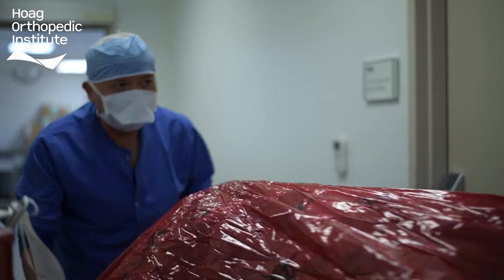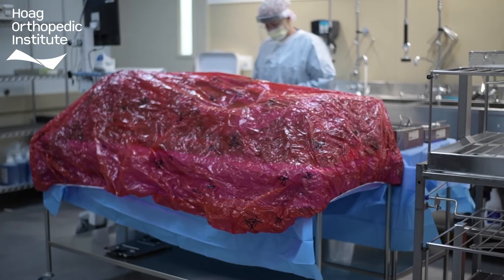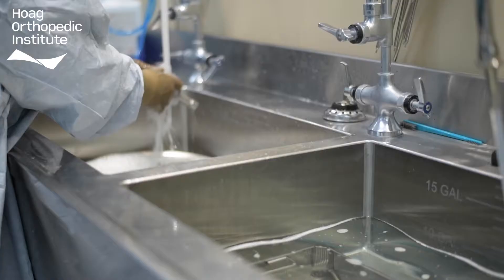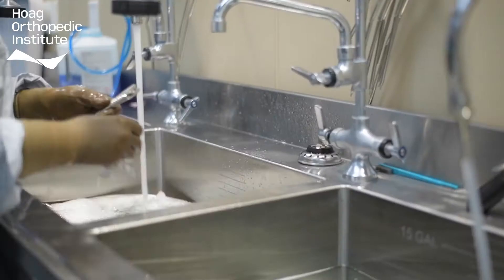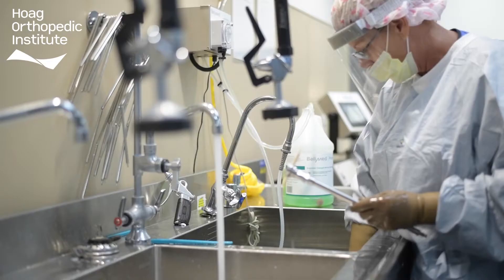At HOI, instruments are returned to the decontamination room after surgery and the instrumentation reprocessing begins. This process starts by soaking and manually cleaning each instrument in a water and detergent mixture. This helps to break down the blood and material left on the instruments post-surgery, also known as bio-burden. A variety of different brushes and irrigators are used to remove any remaining or difficult to remove bio-burden from the instruments.